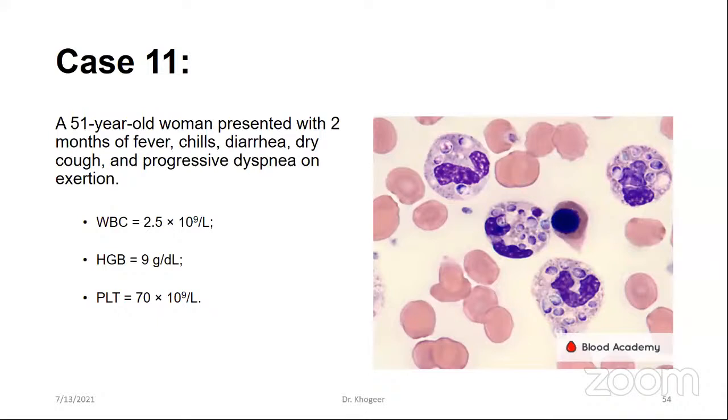Yes, is there any case slide for infectious mononucleosis? The case that I showed in my presentation is from a patient who has infectious mononucleosis. Okay, next question.